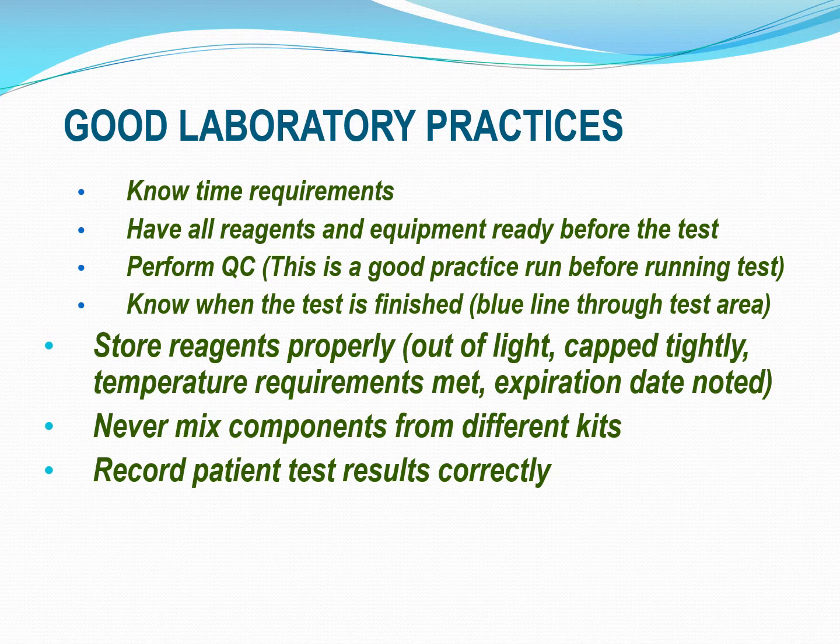You also remember, you have to perform QC. And also, if you have an internal QC on that test kit, like say a pregnancy test, once that kit's open, you may have to run QC on that kit with a known specimen. So you open up the kit for the very first time, you read through it, you know what it takes, you know what you're doing, you get your known QC urine, you run that pregnancy test, that's a positive and a negative. So you take two of your kits out, you run a positive on one, a negative on the other, you know which is which.